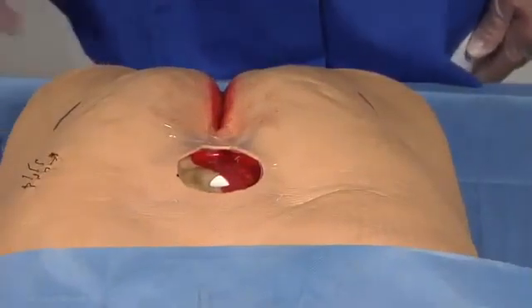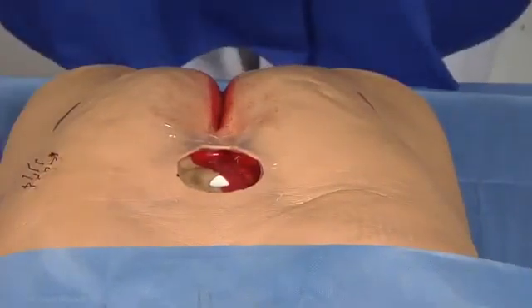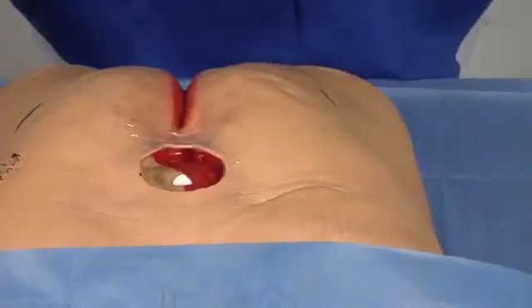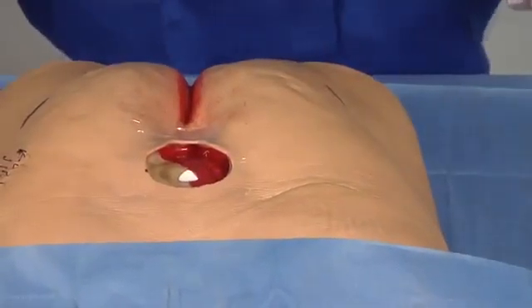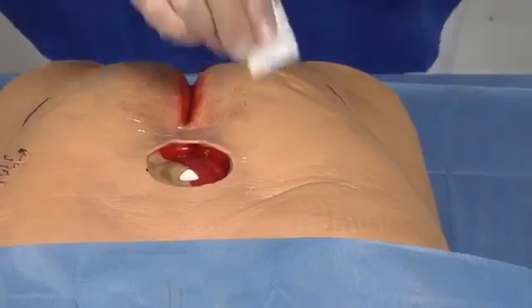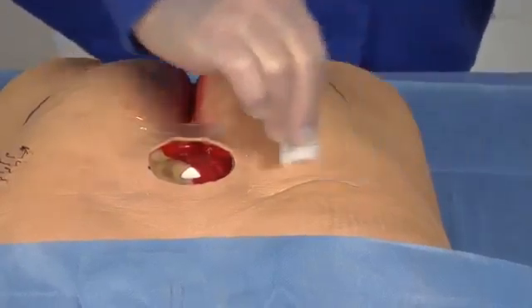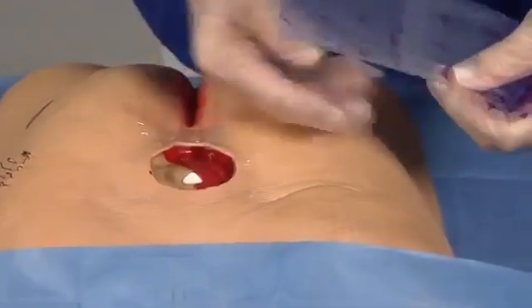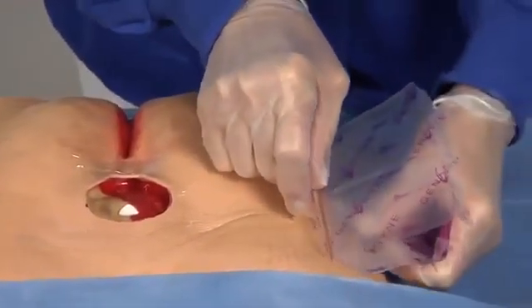If bridging or relocation is required, select the area for the bridge and cut a piece of foam, ensuring the length will be sufficient to cover the area being bridged. Use skin prep to the skin edge and let dry. Then apply the transparent film over the area.